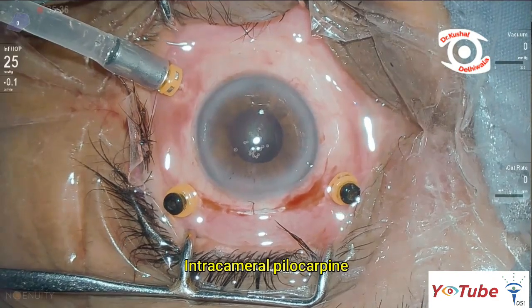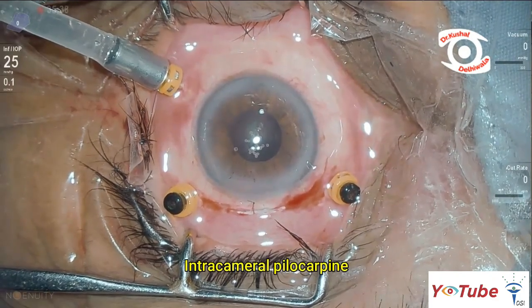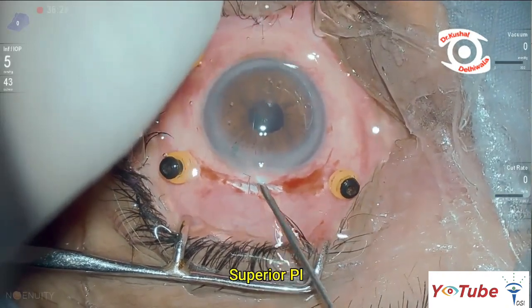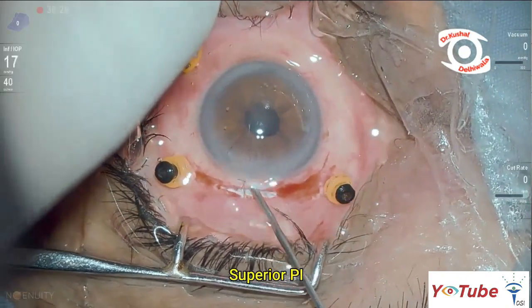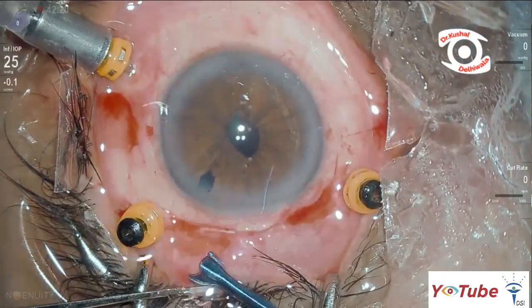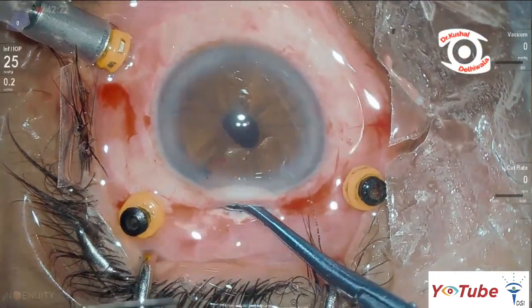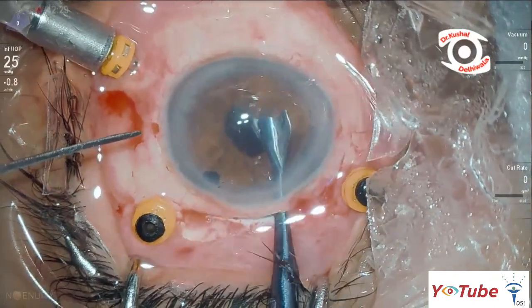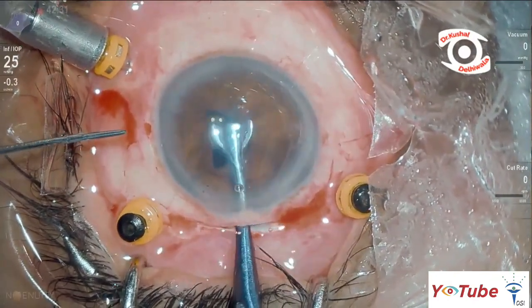The pupil was constricted pharmacologically and a superior iridectomy was performed. Using customized forceps and spatula, the iris claw lens was fixated in the retropupillary plane.